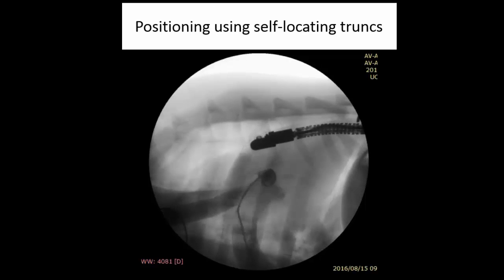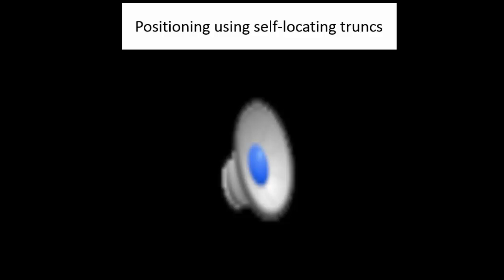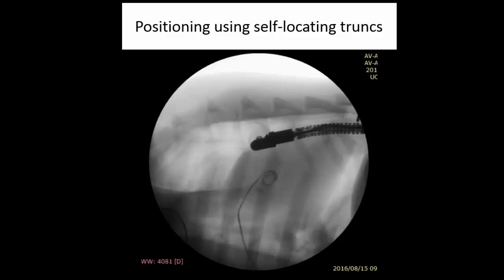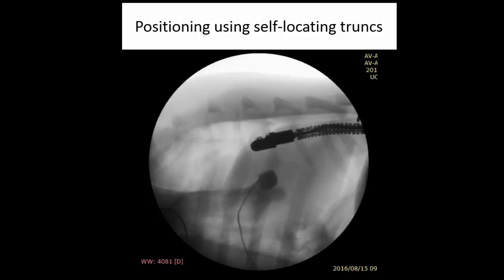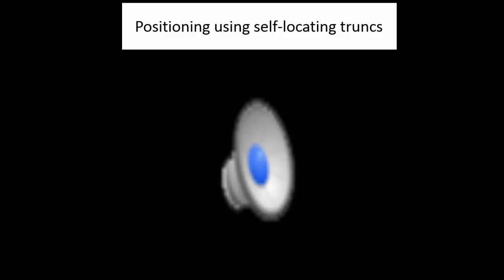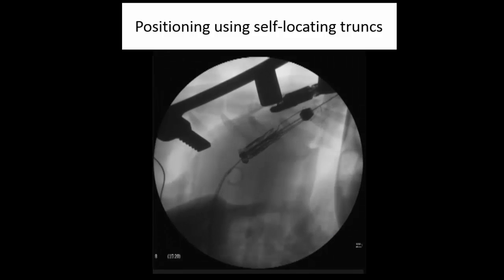So I'll just briefly run you through the procedures. The next few fluoros that you will see are basically lateral shoot-throughs. The sheep's head is on the left-hand side with the diaphragm, as you can see, on the right-hand side. So we start out, because there's no fluoroscopic footprint or mark from a calcific process, by doing an aortogram just to identify the position of the root. Once this is done, the device can be inserted transapically via a subxiphoid incision.